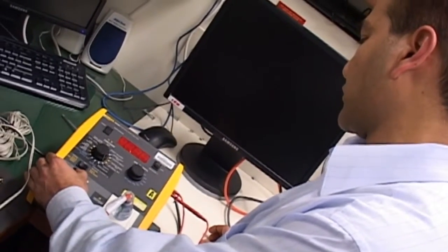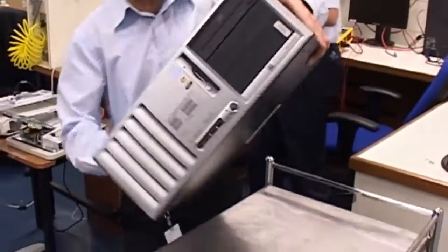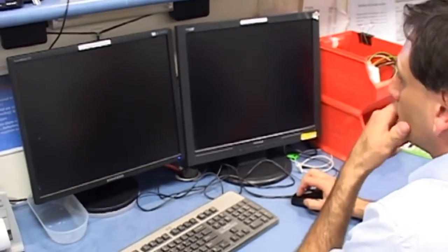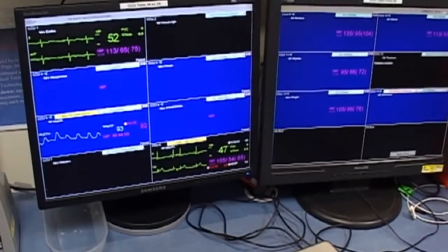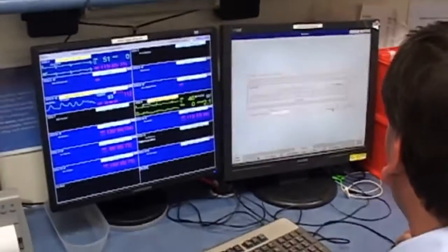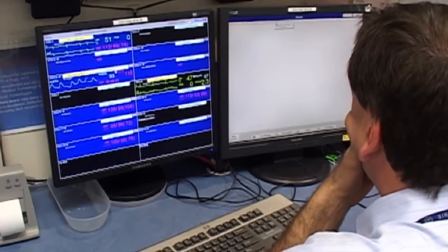Patient monitors in the high criticality wards are then monitored via a central computer, which for the most part looks like a standard computer, but essentially it's a medical device because it's relaying patient information. So it's actually very critical. So, for instance, your coronary care wards, where one nurse could be looking after 4 bed areas, it's easier to monitor them via a central location.